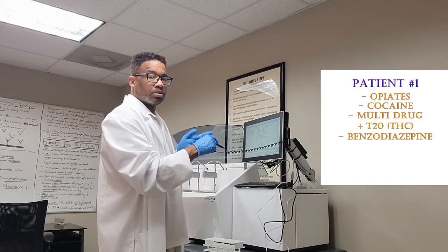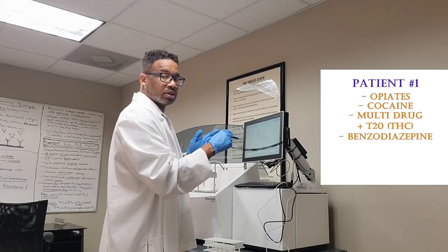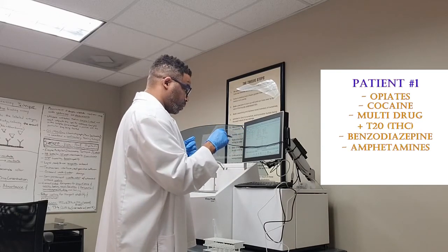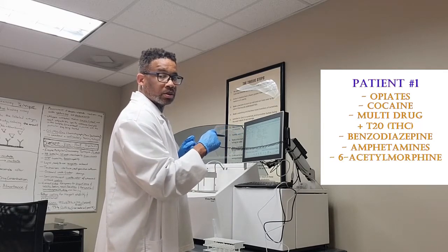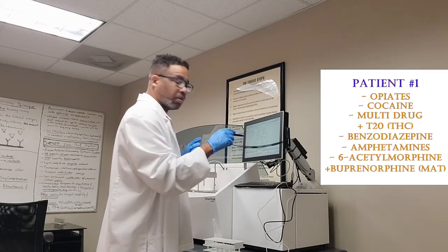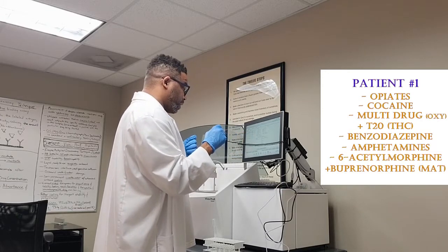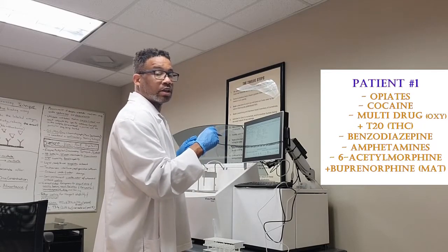But then again, it could be that our testing strip that we use as a control for this sample was too sensitive. So we'll go down here, and negative for amphetamine. We didn't suspect that. Negative for 6 AM, which is a heroin derivative, and we pick it up within 6 hours of use. Boop, positive like we expected. Negative on our OC, which is our oxys, and creatinine is at a decent level, so the sample was not compromised, it's valid.